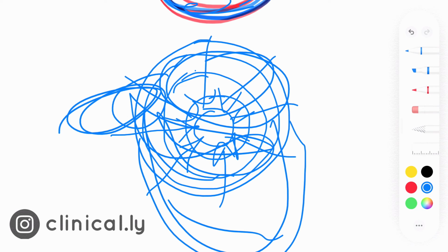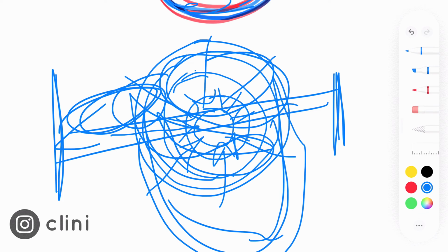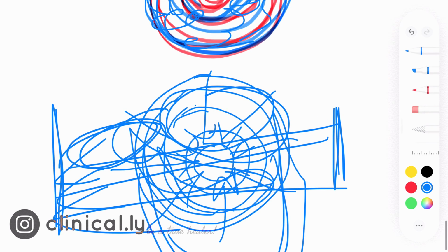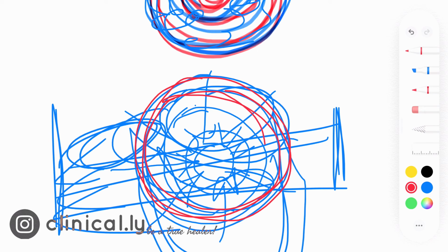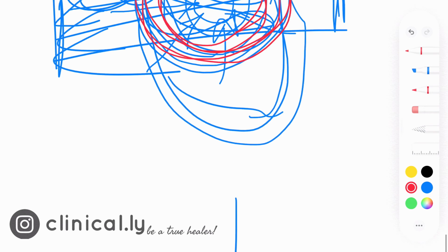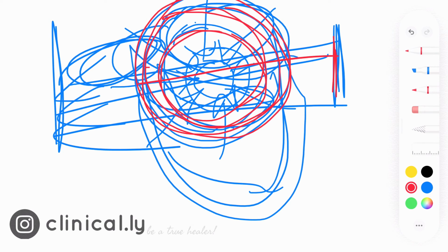The entire left ventricle, from the epicardium towards the endocardium, gets repolarization, because a large number of cells, the entire epicardial cells, repolarize, and then their subsequent neighbors repolarize, and then subsequently their neighbors repolarize. It kind of creates voltage which is in the direction from the epicardium towards the endocardium.